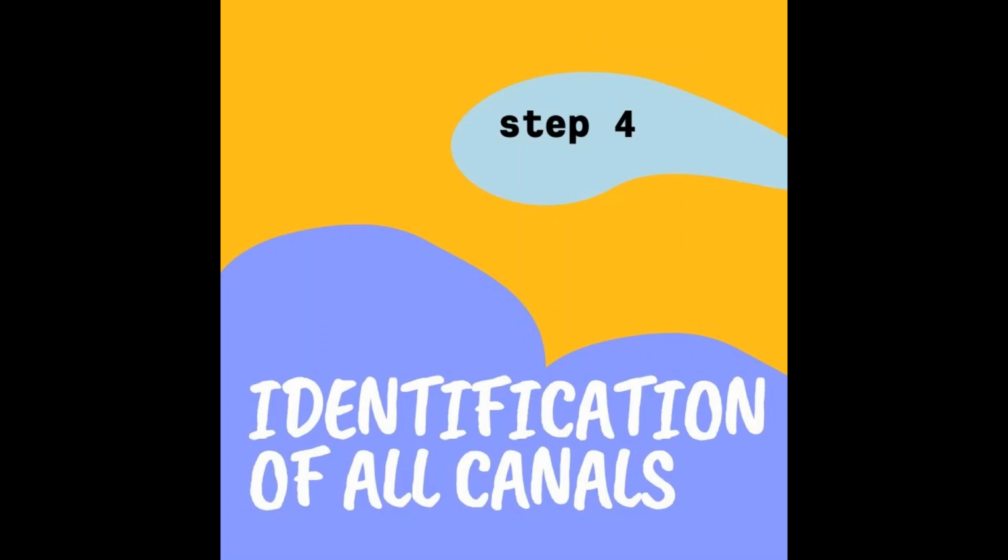Now here you can see that someone has gone the wrong direction twice. He didn't realize the angulation, the long axis of the tooth, so he stopped, took a radiograph, then he can reorient his burr.